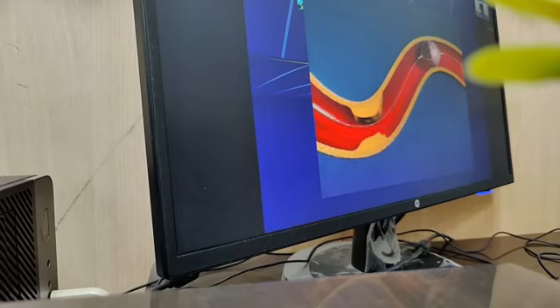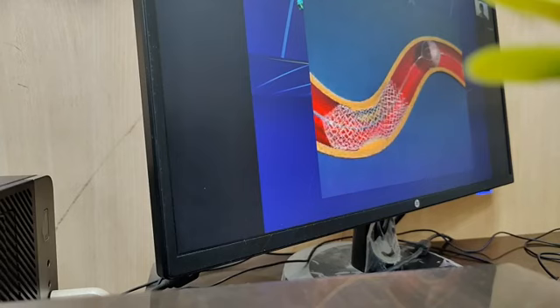This is how you put the device distal to the lesion, and then you perform balloon inflation of the lesion, and then you can see that the embolic material is trapped by the filter. You perform the stenting here, and again there is a distal embolization which is trapped and does not go distally. Then you remove the protection device filter, and this is the nice result you receive.